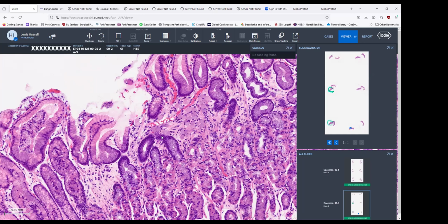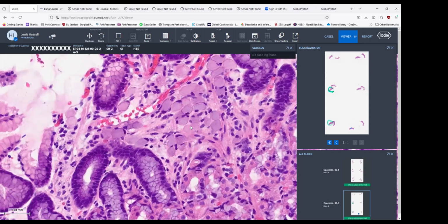And I'm not sure that I would do that, but I think these most likely are signet ring cells of a gastric poorly differentiated adenocarcinoma. I don't see many other things that it could be. There's a very limited amount of things that we could do with this. I suppose you could do some immunohistochemical staining.